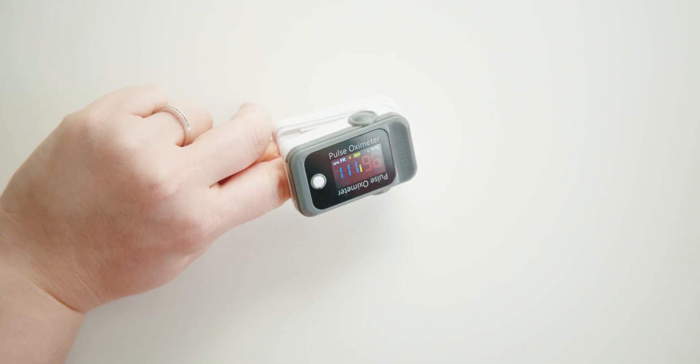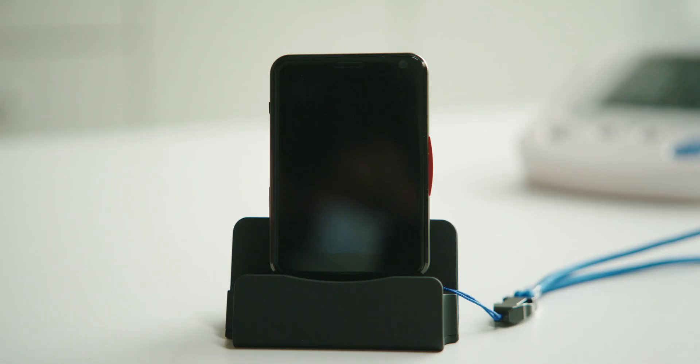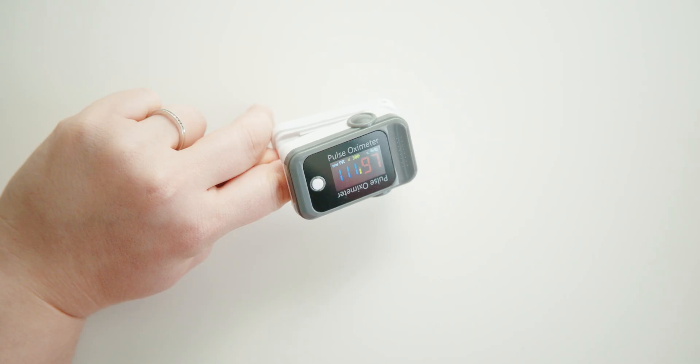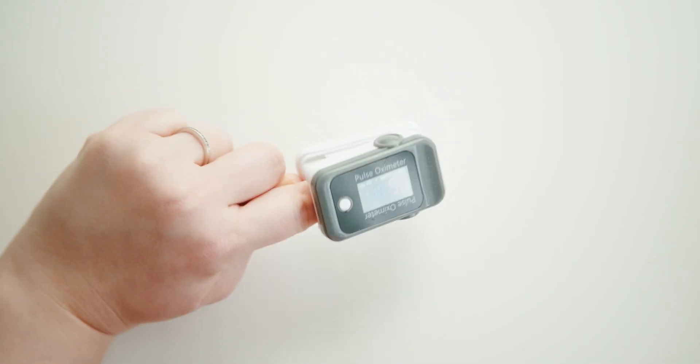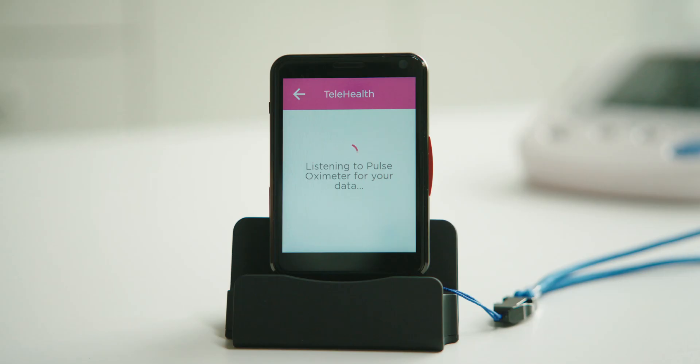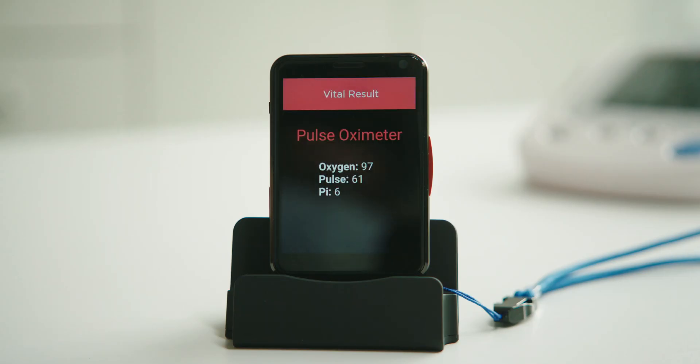As long as the Link Plus is connected to the dock and plugged into an outlet, it will automatically recognize the pulse oximeter device. Wait for about 30 seconds to a minute, then remove your finger. Once you've removed your finger, the Link Plus will display and transmit the reading to your doctor.